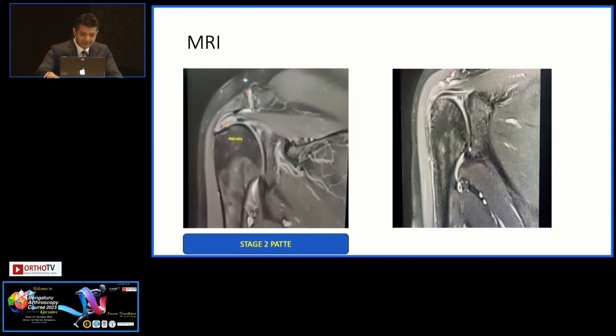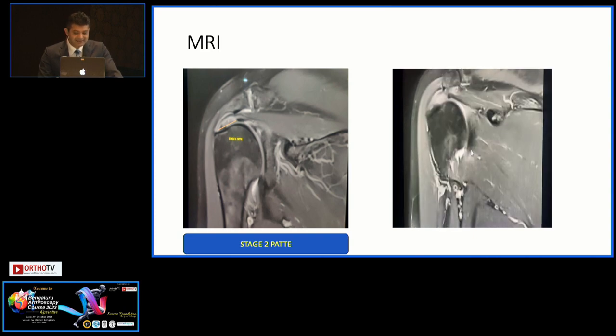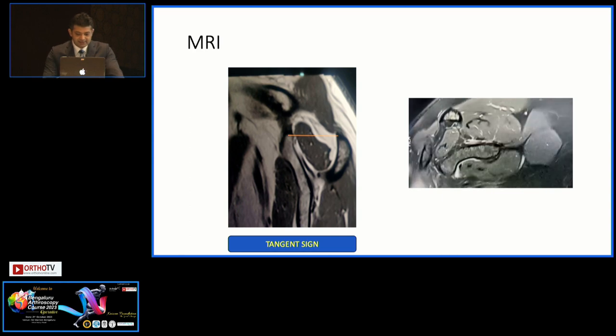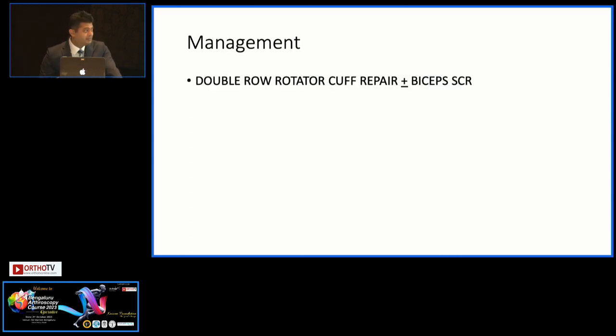And on MRI, we had a Patte stage 2 with mild retraction of the supraspinatus tear, the complete supraspinatus tear, fatty infiltration, a clear stage 2, I would say. And management here would be double row rotator cuff repair, plus or minus a biceps SCR.